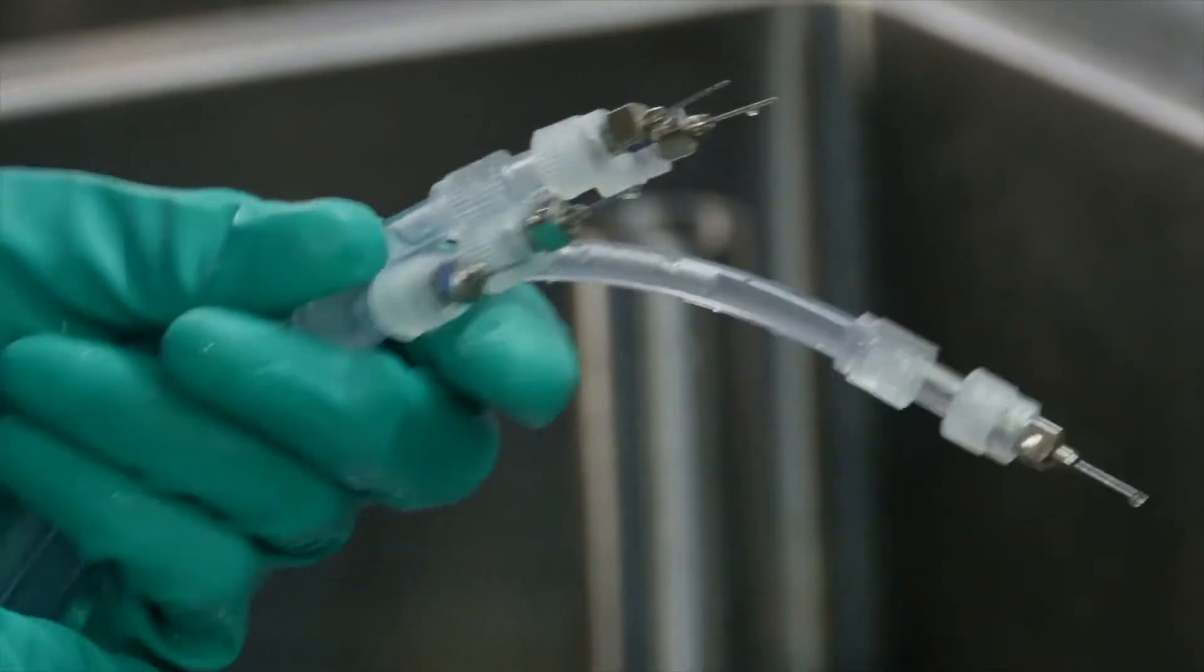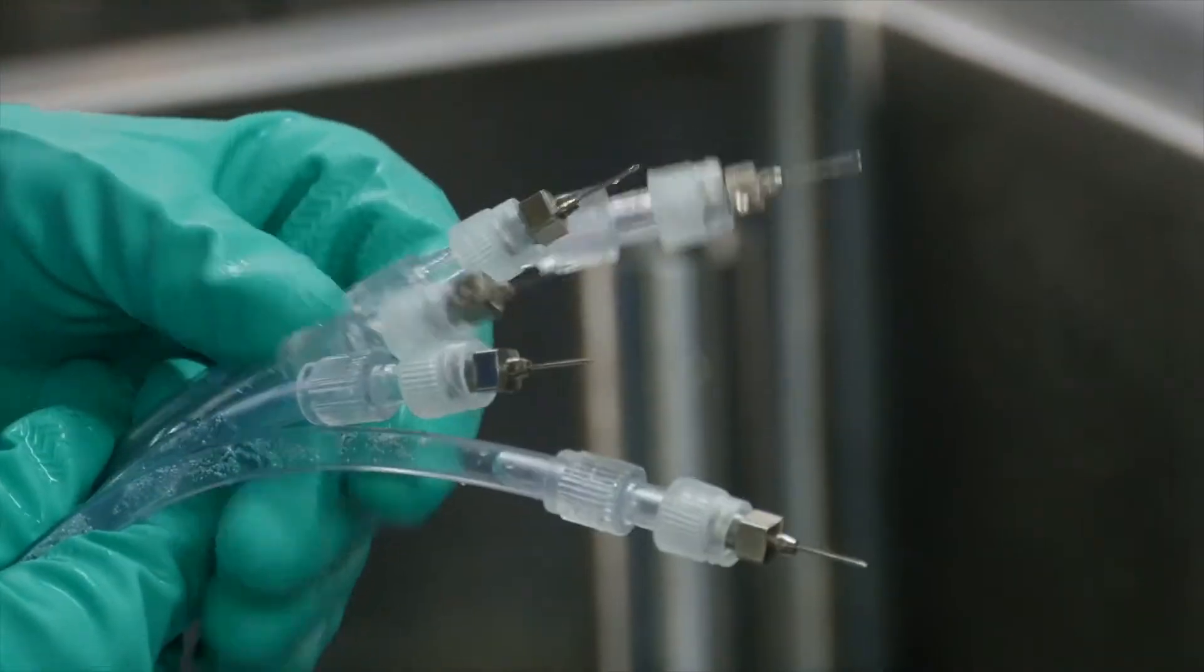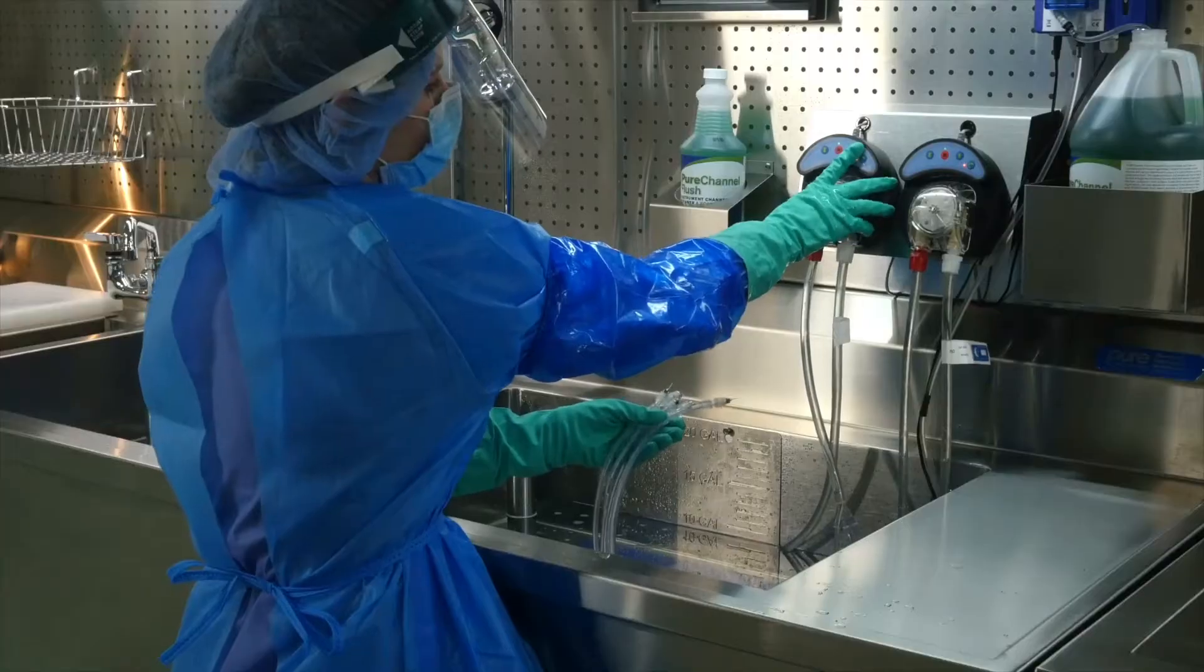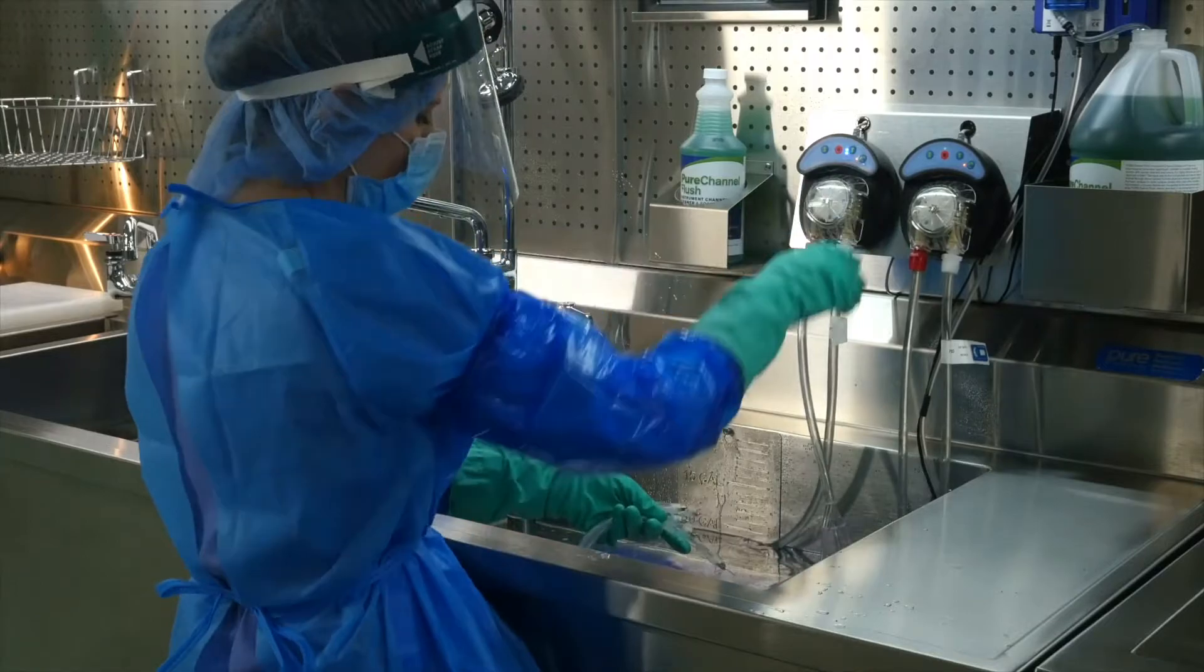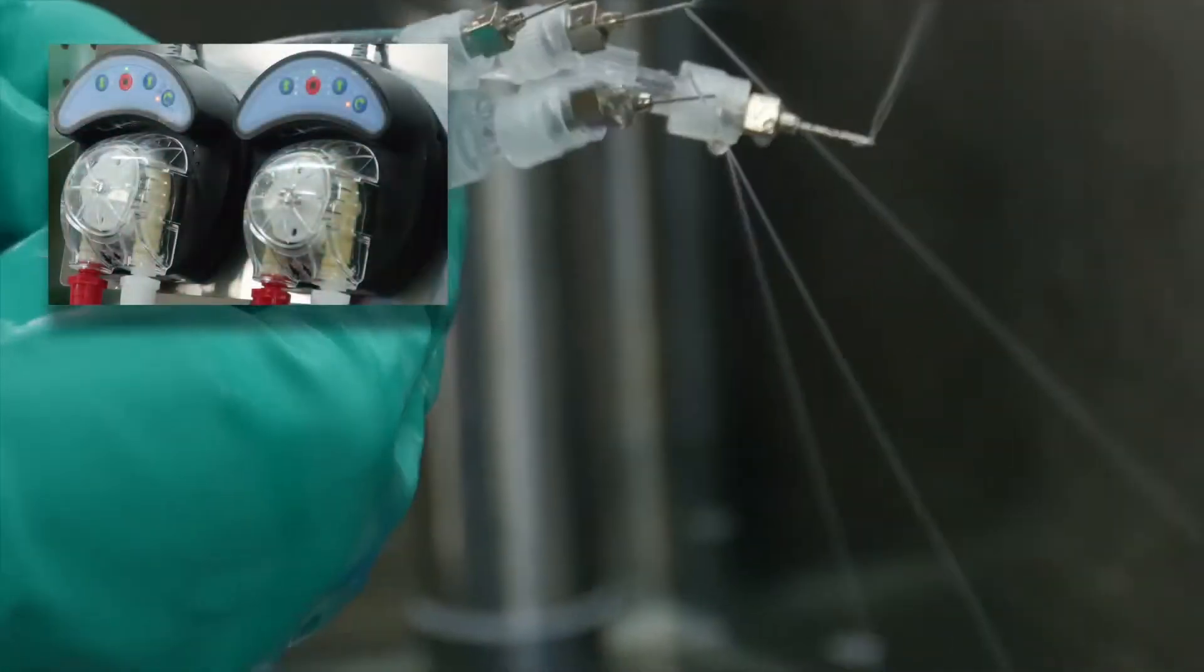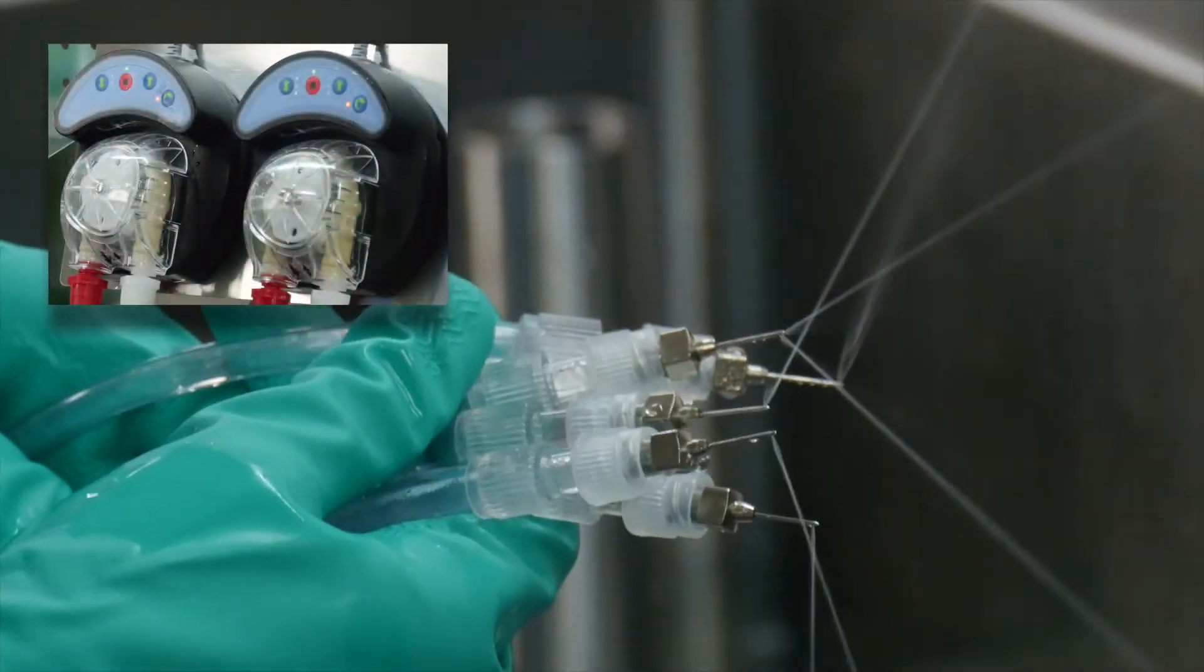The smallest lumens should be flushed on low speed, which is set by pressing the dial button once, illuminating one LED light. Suction tips and eye instruments are good examples of tiny cannula.